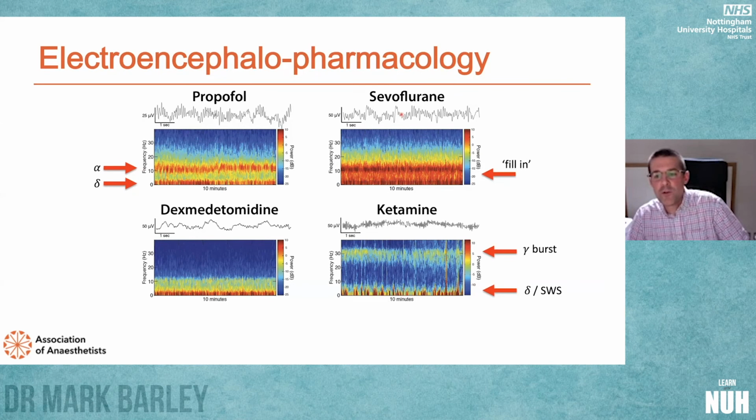When we use sevoflurane and start to get to around or just above a MAC value for that individual patient, we start to produce these theta oscillations, and we get this big block of red at the bottom.